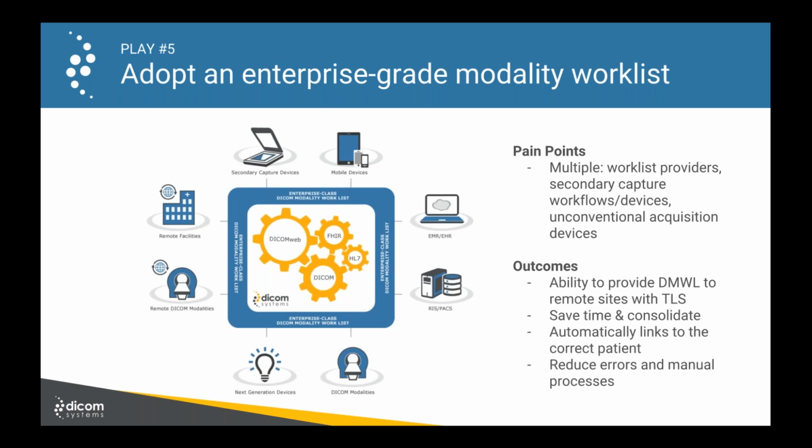And so one of the things we found, and this is one of the biggest challenges, and I think Chris touched on that in the mammography space, is that once you've created the primary exam, rightfully so, that worklist entry is supposed to drop off, and it's not supposed to be cluttering the worklist with a technologist.